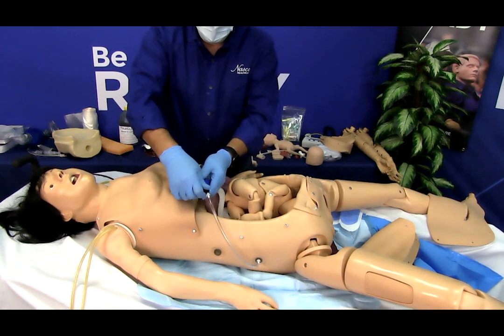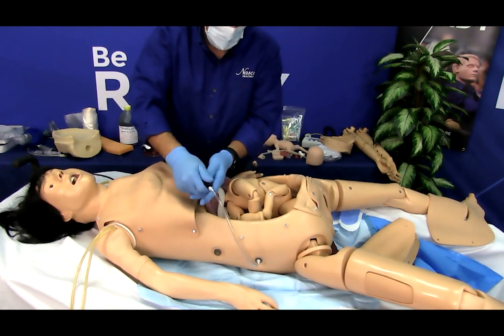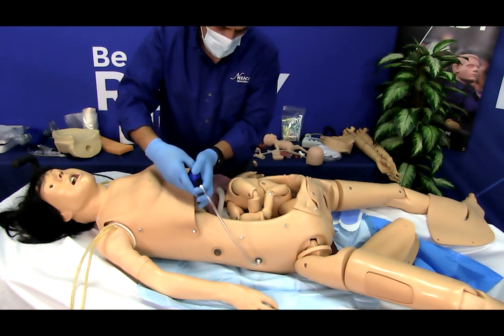After the appropriate actions have been practiced, open the valve on the squeeze ball to fully deflate the positioning bag and complete the birth process.